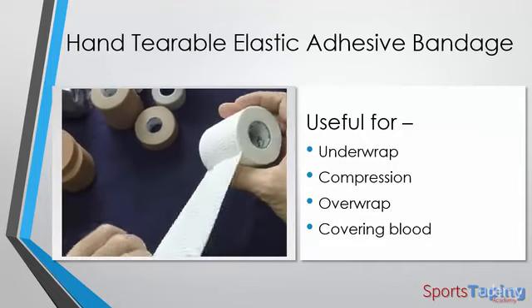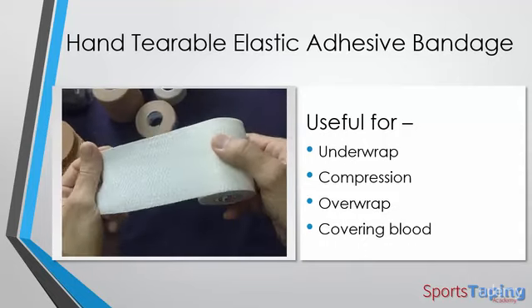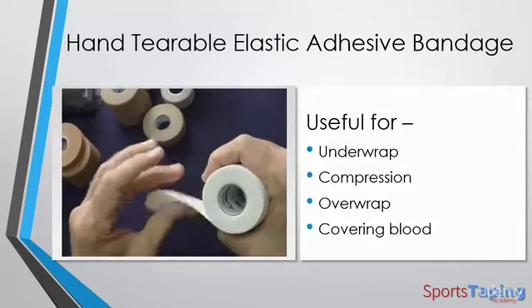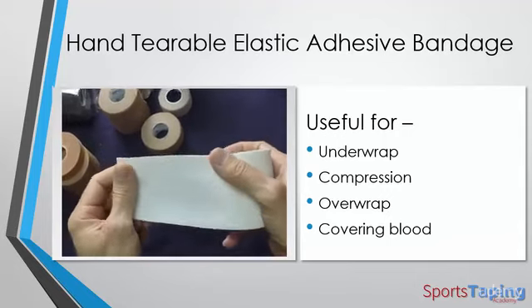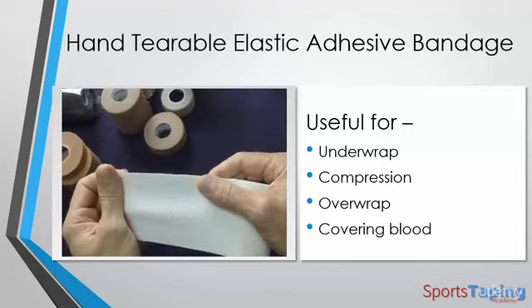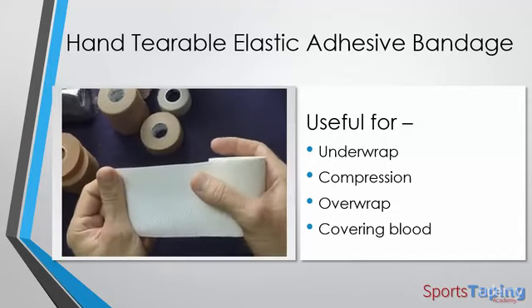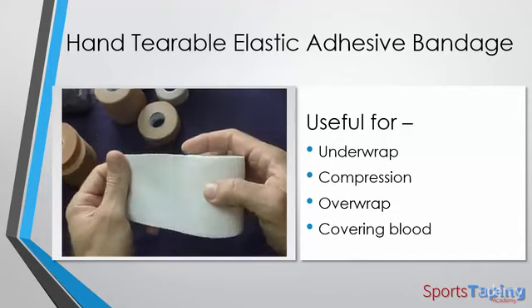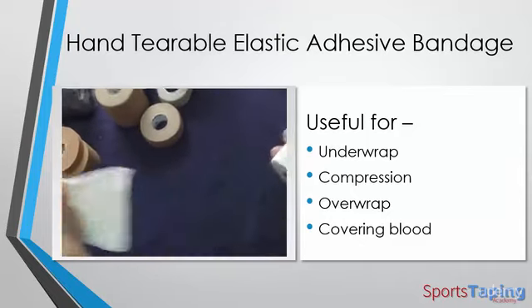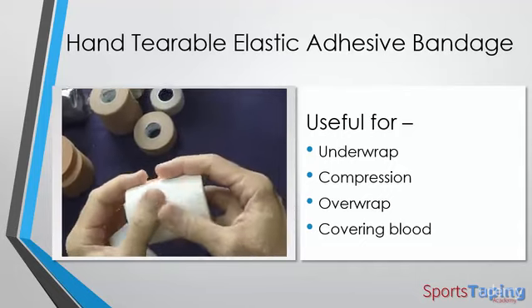I like to use this as an underwrap. So if somebody is allergic to tape, I will use this type of tape first as an underwrap to go down onto the skin, because it's sticky. It will stick to the skin, and then I will use the rigid tape over the top. I can also use this as an overwrap, and because it's very, very highly absorbent, it's used to cover up blood. So any sort of bleeding wound during competition, you can wrap this around and it will absorb the blood. And why they call it hand tearable, because simply you don't need scissors. You can just rip a piece, so you can wrap around, rip, and then lock it down.